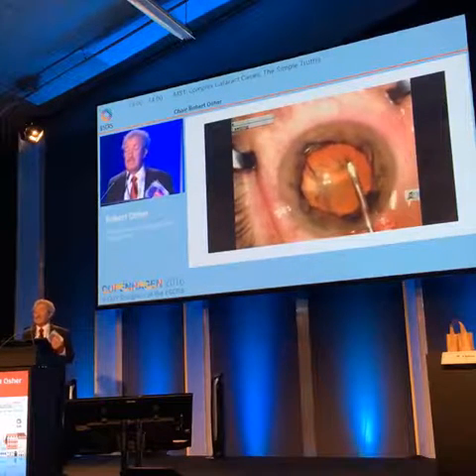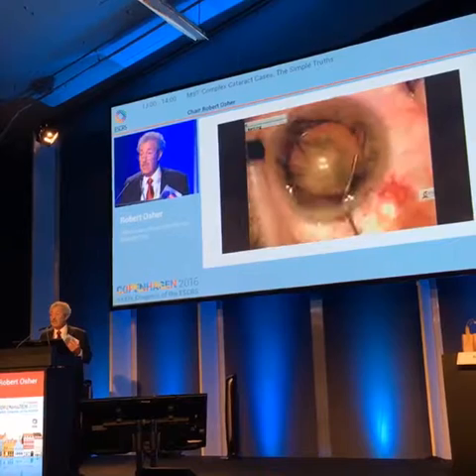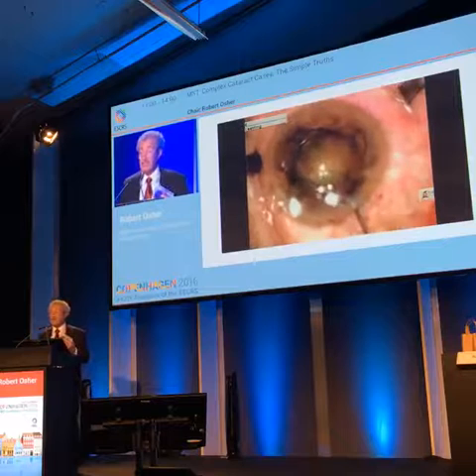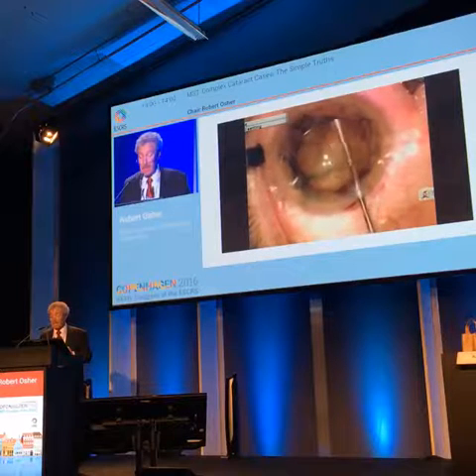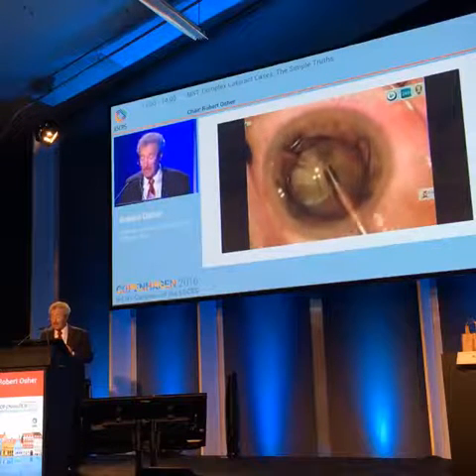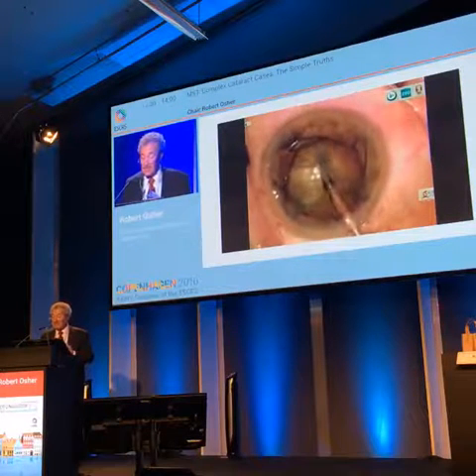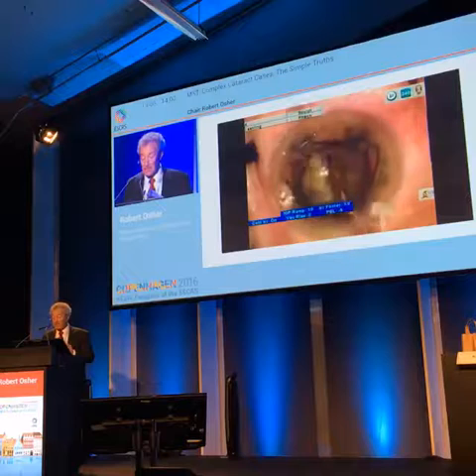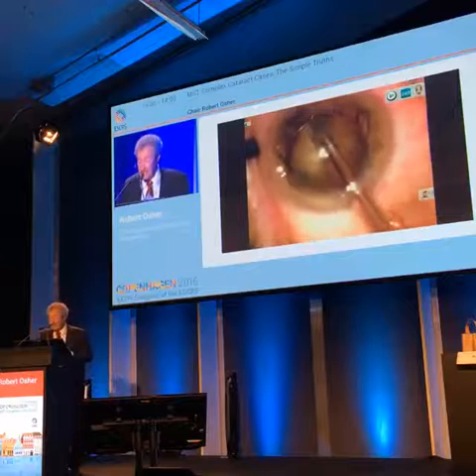Again, look how easy it is to put in the Malyugin ring and the beautiful exposure you get with this new ring. The old ring was fine. And this ring, I believe, also comes in 2 different options, probably 6 and 7 millimeters. I refill the eye with OVD, and then I use my bevel down phaco tip from Alcon. I have no financial interest, but it keeps the OVD in the chamber. The OVD doesn't get to the probe, and then I turn the probe over, and I sculpt deeper with lower vacuum so I don't pull the OVD into the groove.